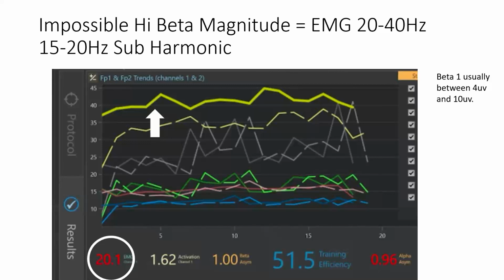So the minute you're up over 7 or 8 microvolts, you're probably pretty contaminated with EMG. The statistical analyses I've done, with n-size numbers in the tens of thousands, if you analyze it really, you can see in the variance and playing with it and doing modeling that a lot of all of that is muscle tension, and that's confirmed by even more sophisticated analysis than I'm doing, and I'll show you some of that. So whenever you see that yellow line up there over 8 or 10 microvolts, you know that's not real.